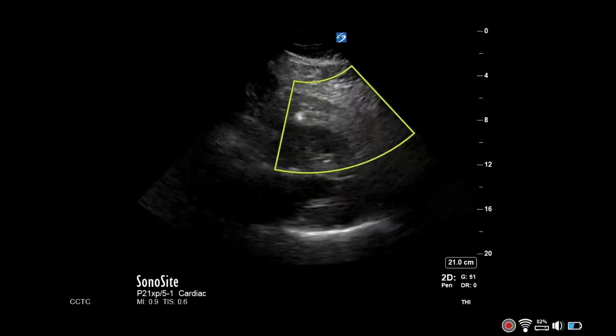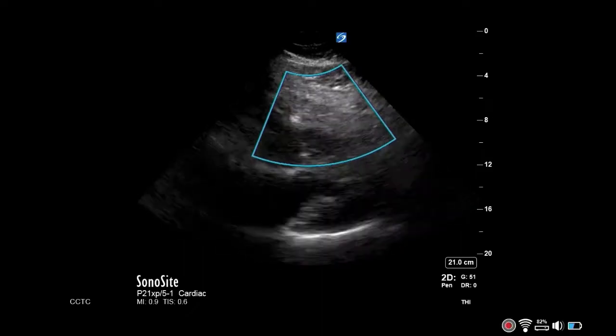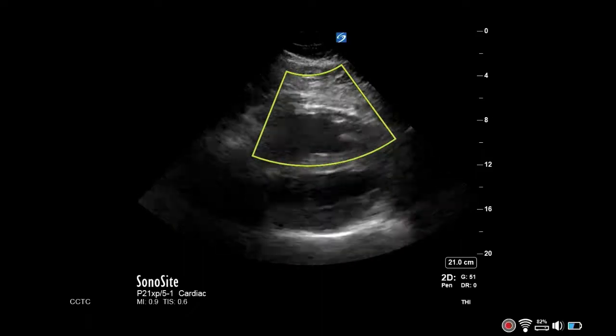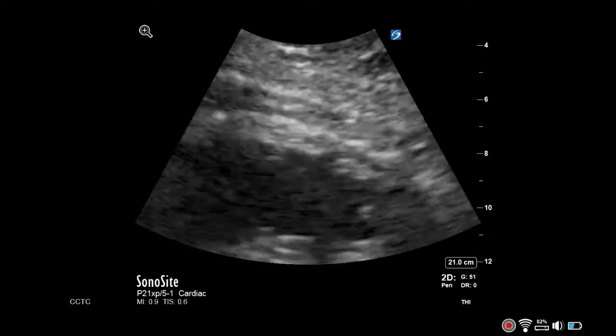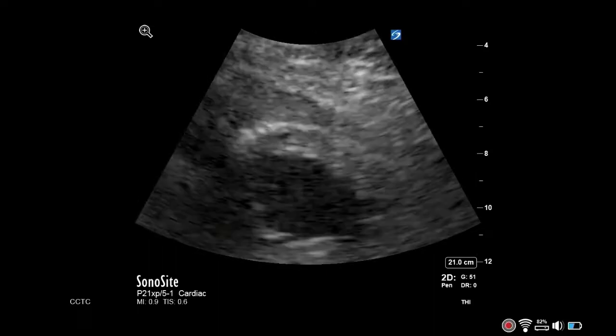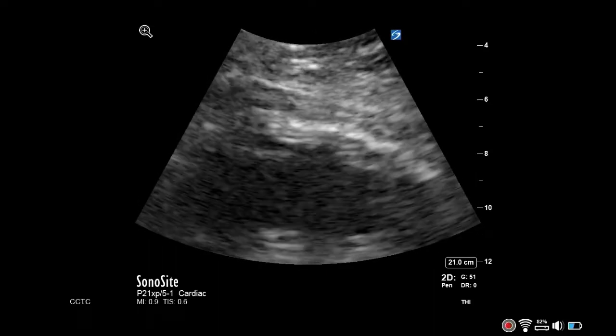The measurement is done in diastole, so you will need to freeze the screen and scroll to the right part of the cardiac cycle. Zoom in and measure just below the level of the tricuspid valve.